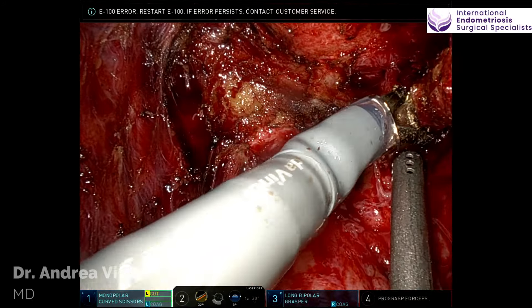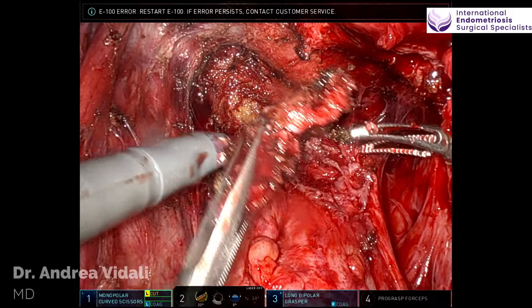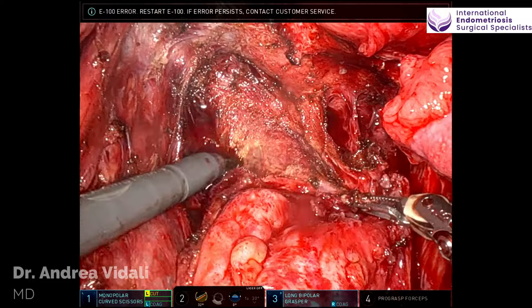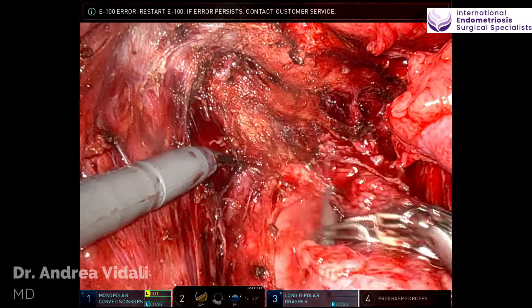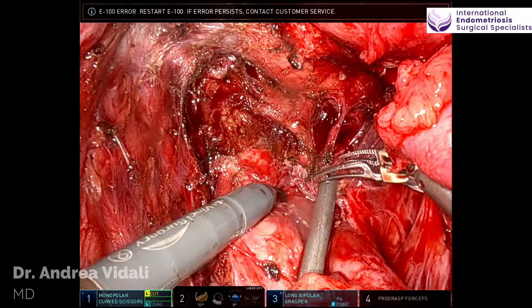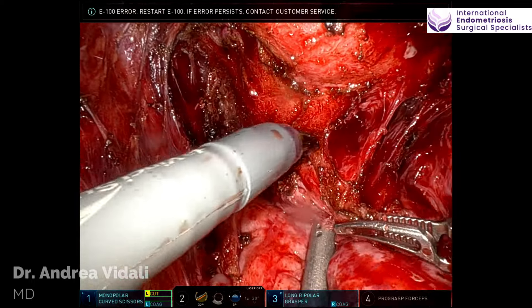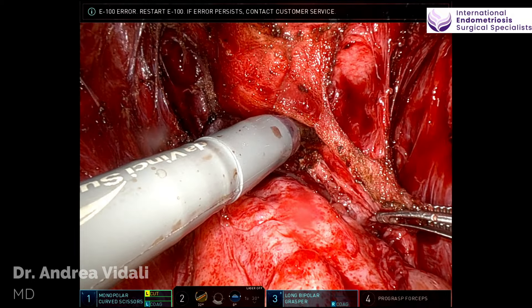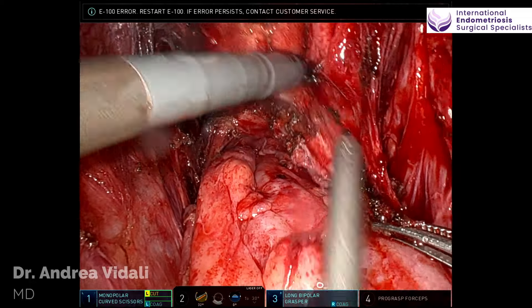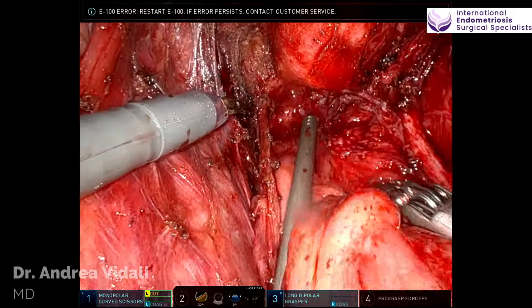You could see that in this case, endometriosis is removed along with some perirectal fat that is clearly abnormal and with desmoplastic changes. My assistant alternates the use of suction with traction on the bowel. I'm also using a VALCHEV uterine manipulator in the uterus, which is very helpful in delineating the posterior aspect of the vagina and the cervix.